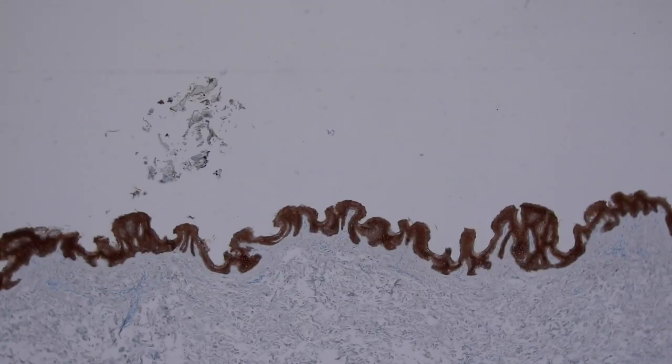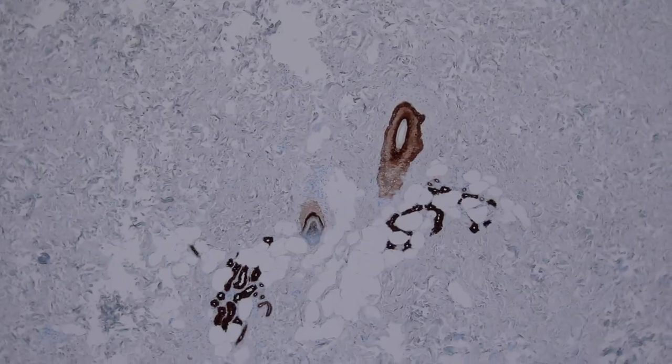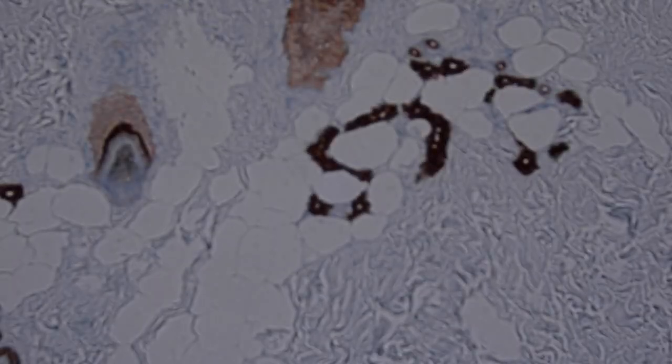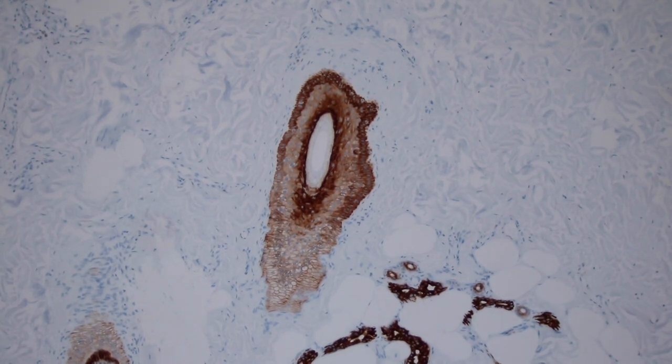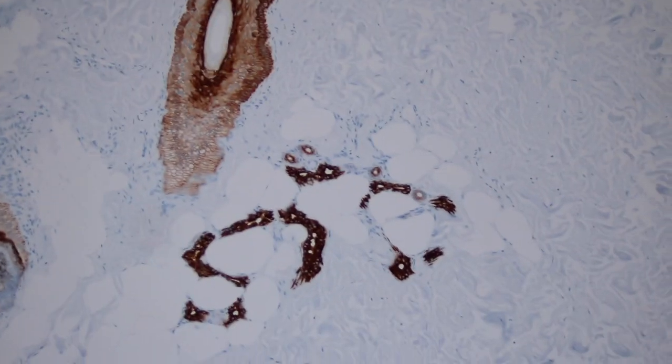So keratin highlights the normal epidermis and when we look down at the structures in the dermis, you can see that these things we talked about earlier, the hair follicle also made of epithelium so it's keratin positive. The sweat glands also made of epithelium so they're keratin positive.